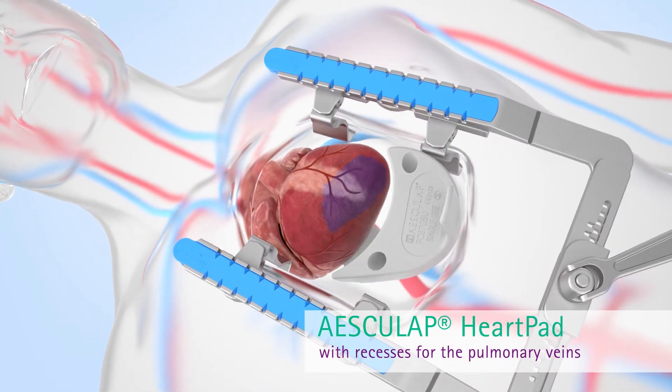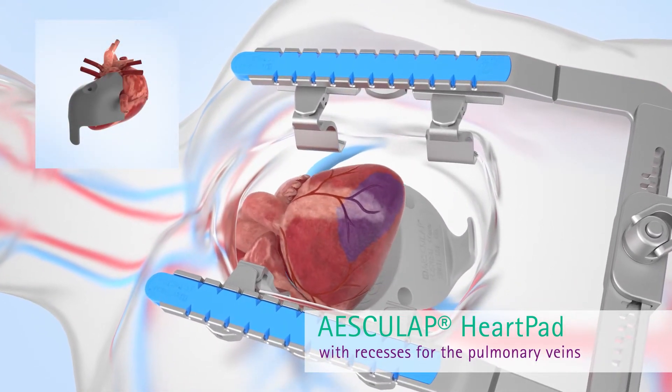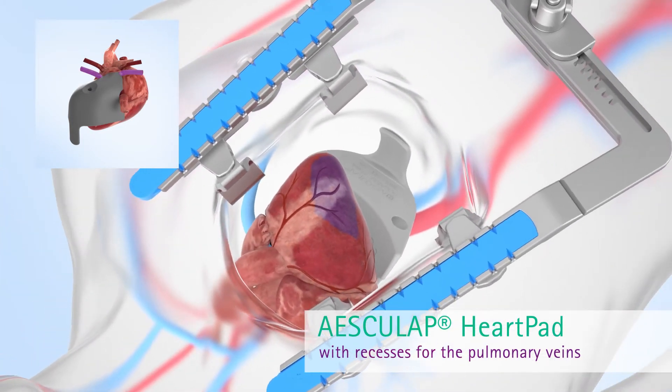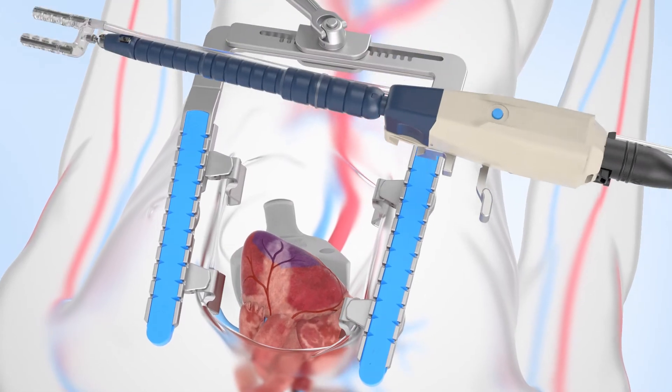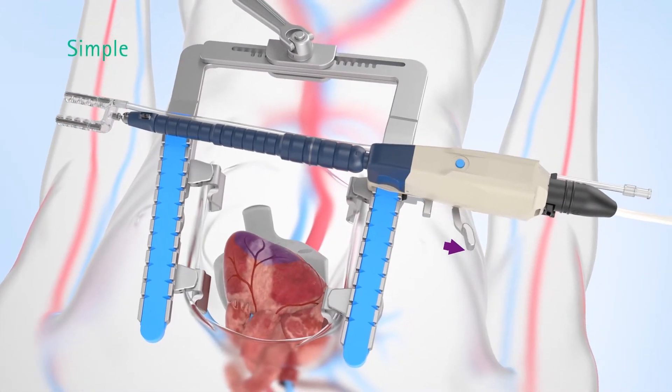The front part of the heart pad rests between the left and right pulmonary veins. The heart pad features special recesses for the right and left pulmonary veins and for the inferior vena cava. The surgeon can lock the FlexHeart Tissue Stabilizer onto the Actractor.